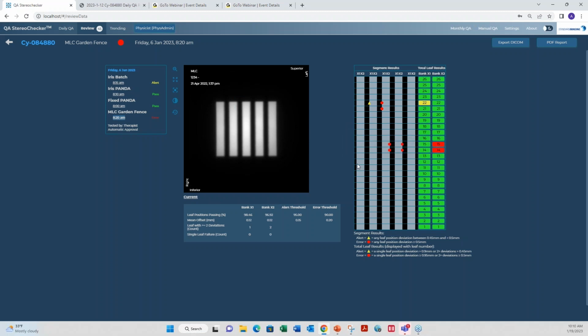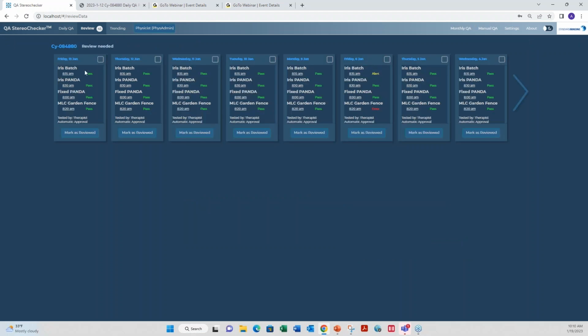It's very important. You get your current image. And again, just to reiterate, once I've chosen that and click start, it's acquiring and analyzing and going to pop up this display for you in a matter of seconds. So from those review tickets, we're just going to go back.